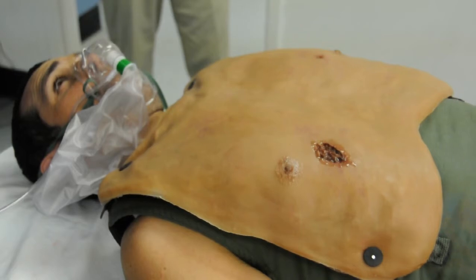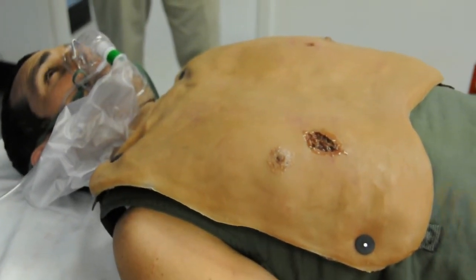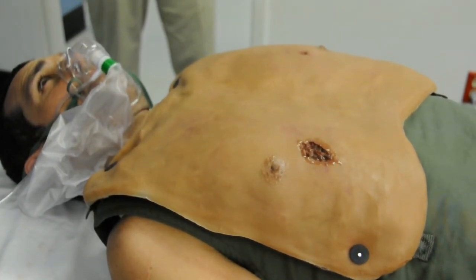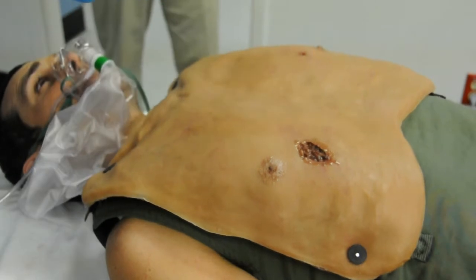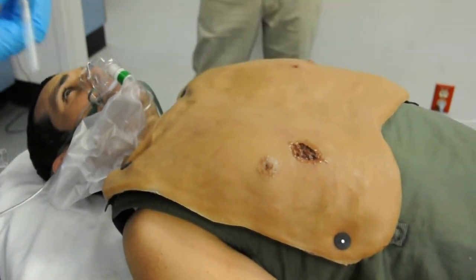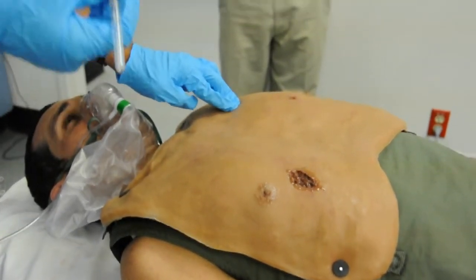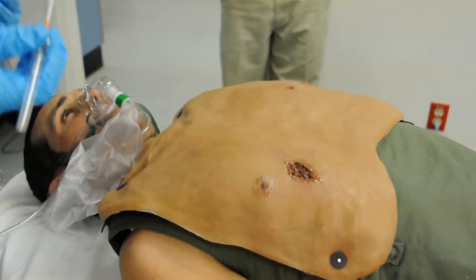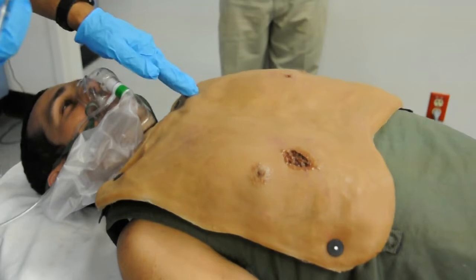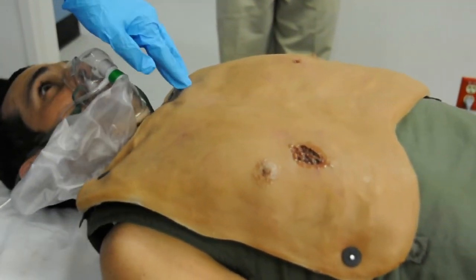You notice his chest rise on the left is not as good, his breath sounds are diminished. In an emergent situation, there's no need for either an ultrasound or an x-ray to identify the pneumothorax. The most important thing at that point with this guy in extremis is to decompress the pneumothorax as rapidly as possible. The way to do that is identify the second intercostal space, mid-clavicular line.